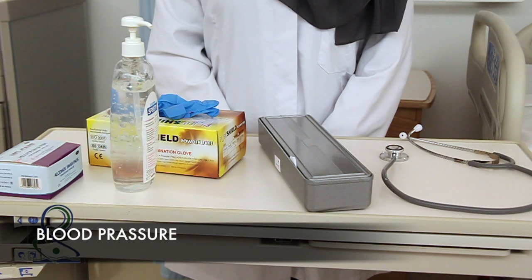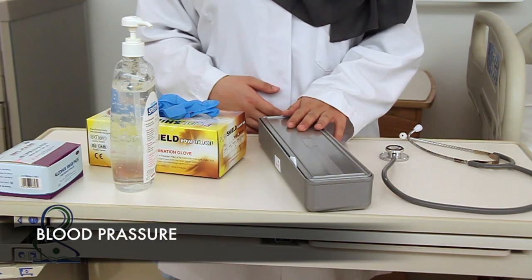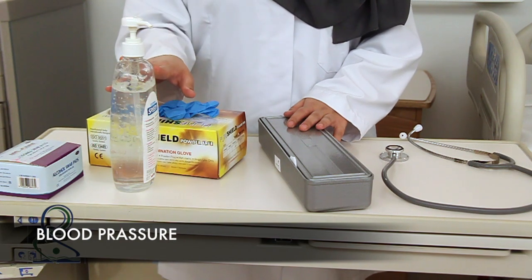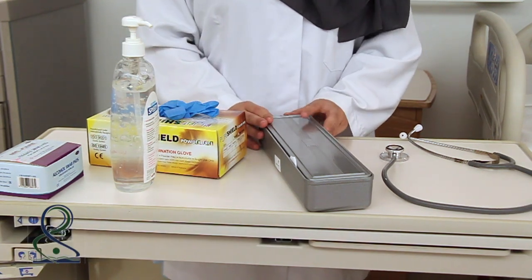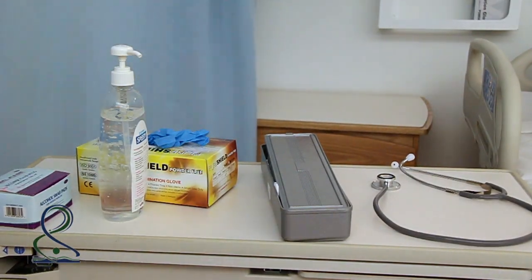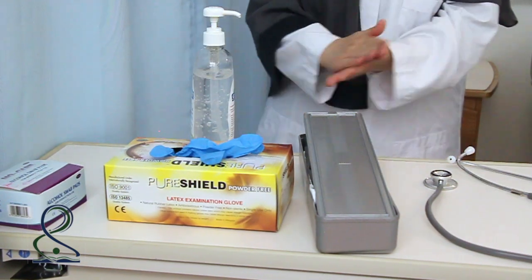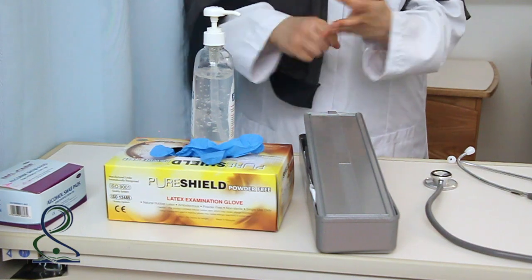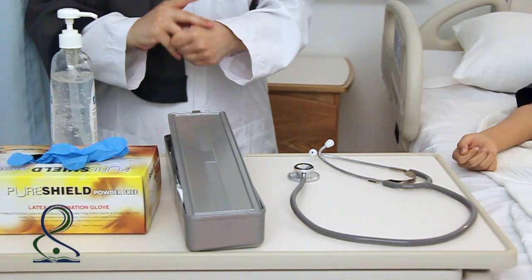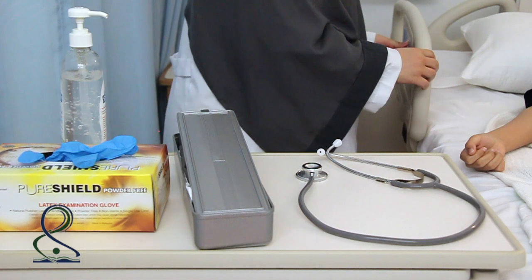For systolic blood pressure, gather a stethoscope, an appropriate size sphygmomanometer, alcohol swab, gloves, and perform hand hygiene. Explain the procedure to the client and provide client privacy. Perform hand hygiene before beginning.